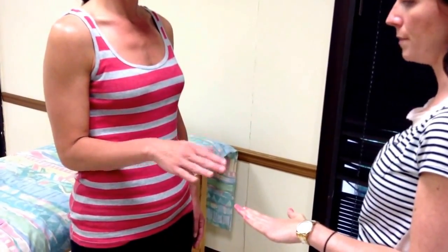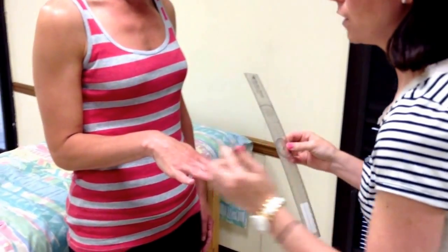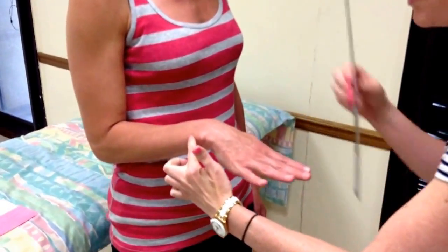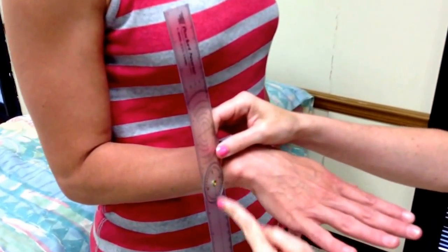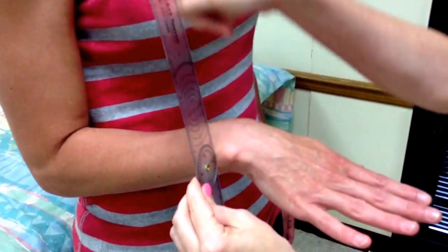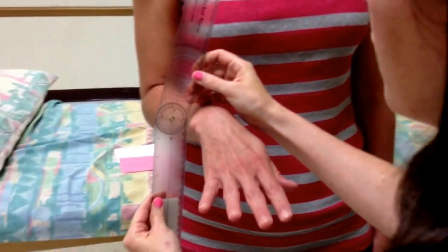First we're going to do pronation, so I'm going to have the patient turn her palm down. The fulcrum is going to go proximal to the ulnar styloid process. The stationary arm is going to be parallel with the anterior midline of her humerus — you can stand behind me to get a good look.